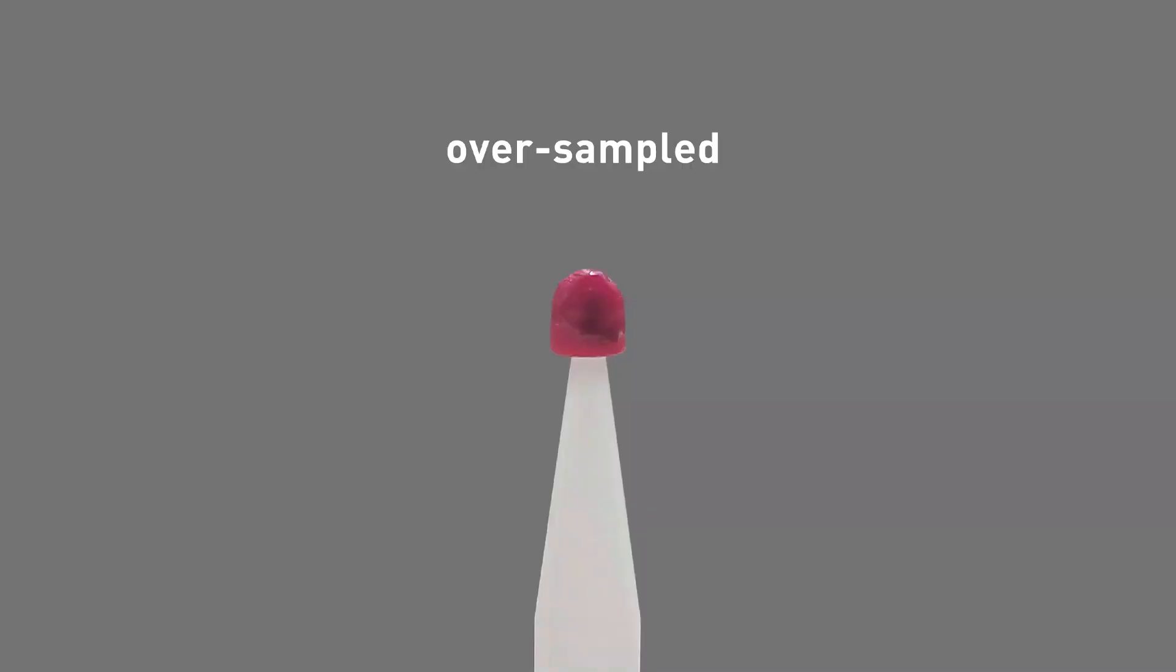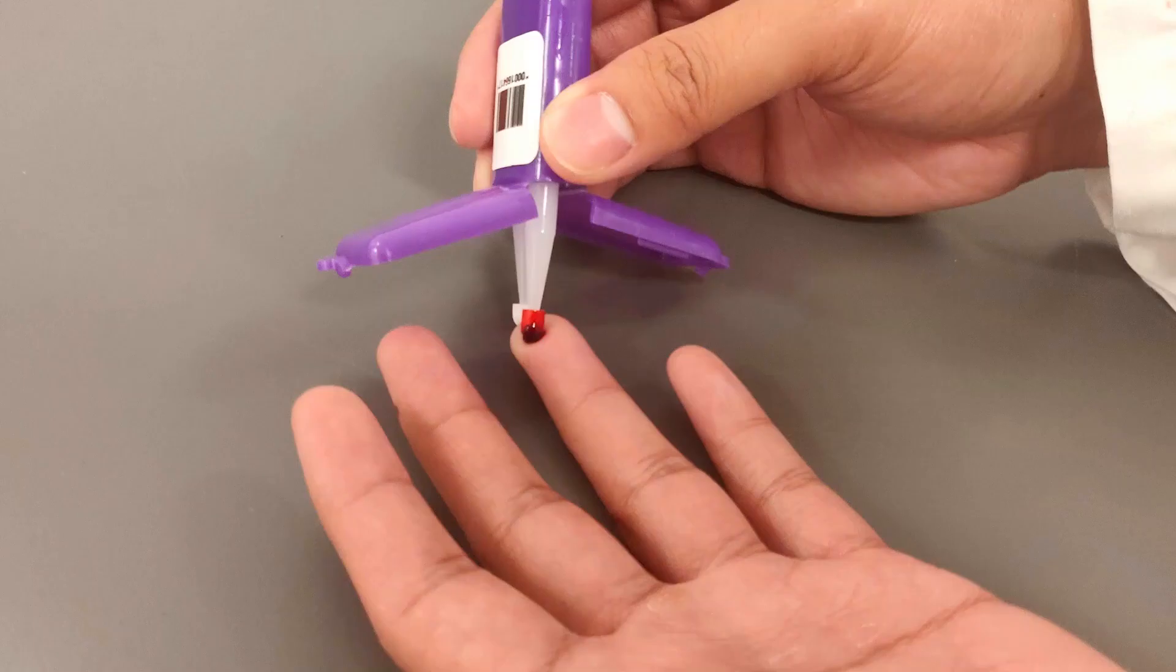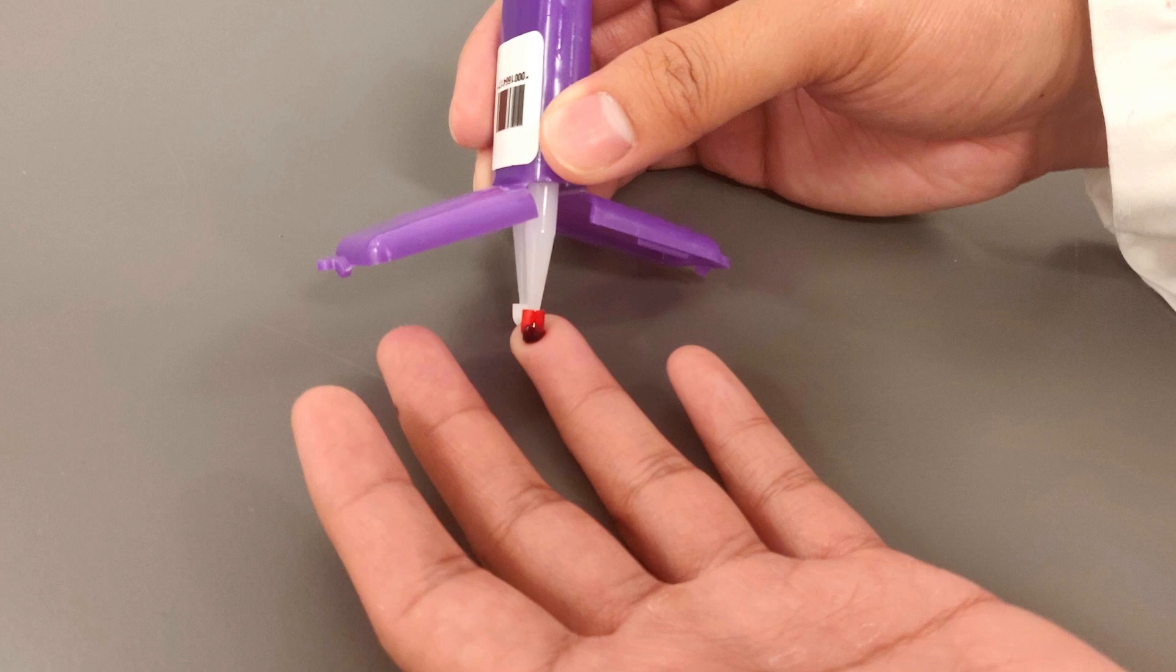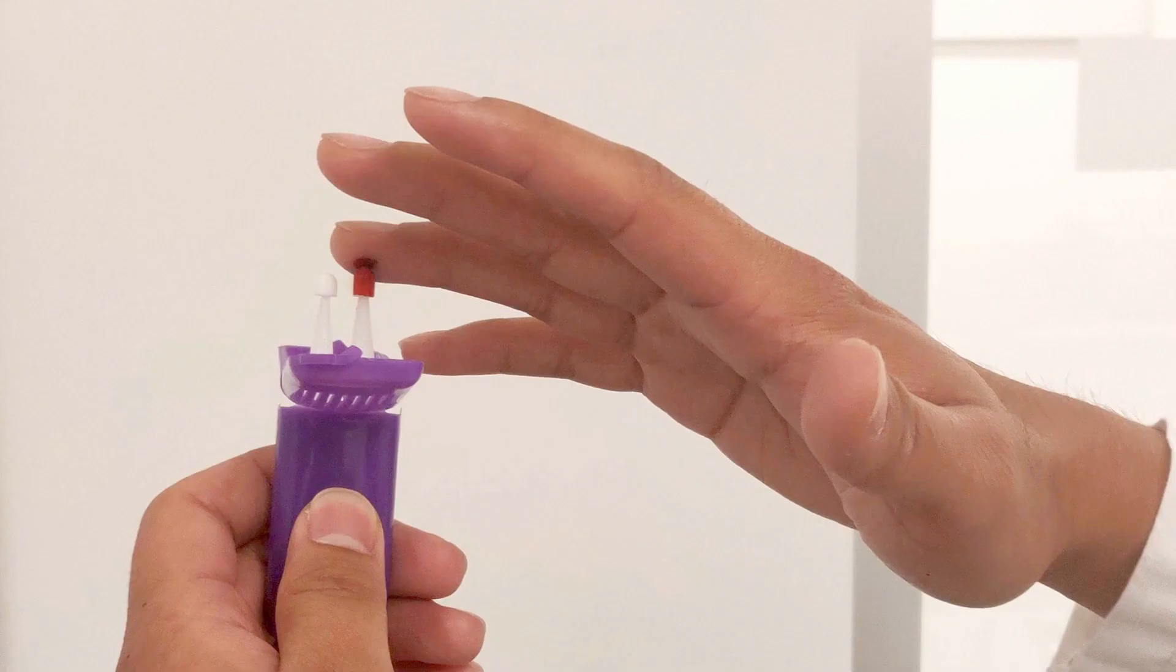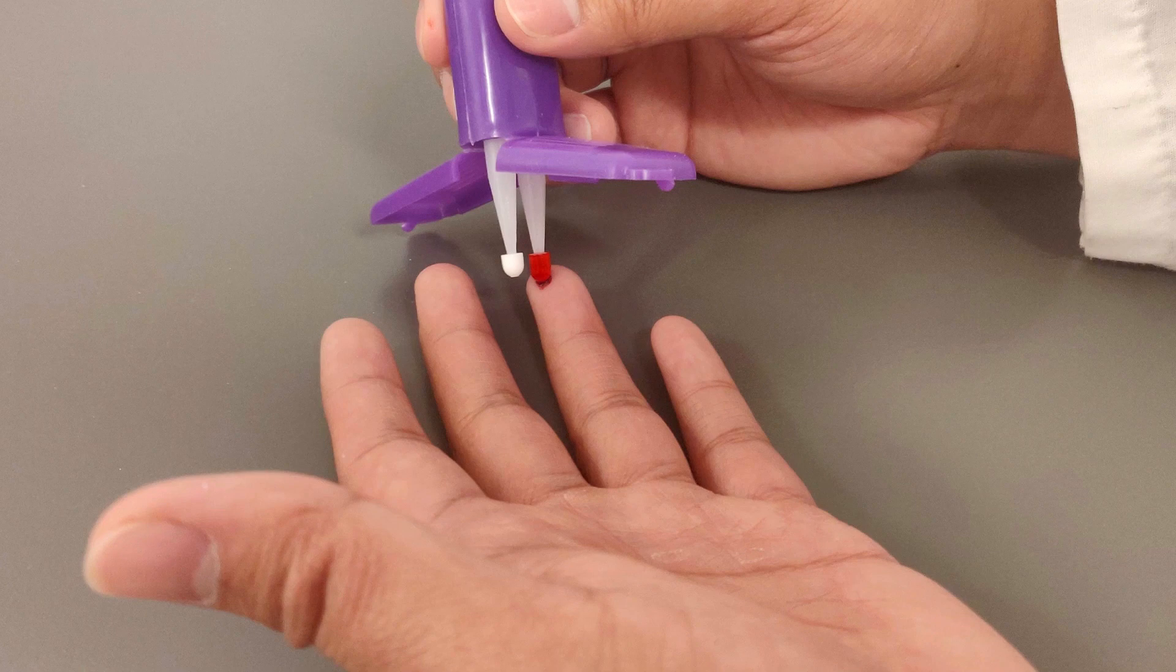If there's too much blood, that can result in over-sampling. Over-sampling is usually caused by three issues. One, the tip is fully submerged in the blood. You want to keep it on the surface of the blood. Two, blood is dripped onto the sampling tip. Three, the tip points upwards towards the sky when it touches the blood. It should point downward towards the floor.